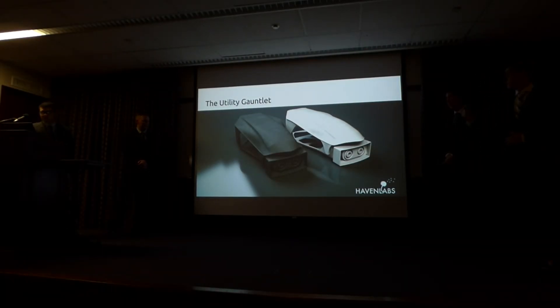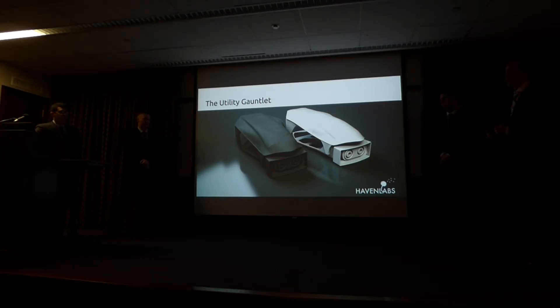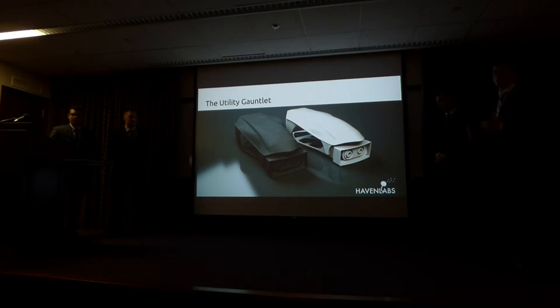This is the utility gauntlet, made by River Castellonio, a senior mechanical engineer who has agreed to help with our project. The utility gauntlet is a lower arm prosthetic attachment that features a 3D printed interlocking mechanism, allowing anyone with the schematics to create an extension for it. We plan to use our actuator hand as an extension to this device, and we're leveraging River's expertise in mechanical design to ensure everything fits together smoothly.